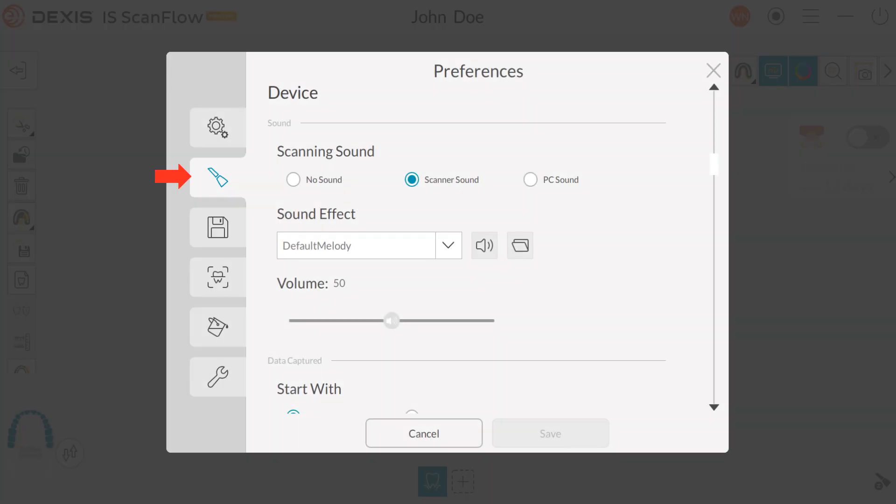Under the Device tab: choose No Sound if you prefer not to hear a sound while scanning. Scanner sound indicates a beeping sound heard each time a scan starts and stops — one beep indicates scanning is in progress, two beeps indicate the scan has stopped and you must re-scan a previously scanned area. A single beep also indicates you have successfully captured a buccal bite. PC Sound — select to have a sound continuously play through your PC when successfully scanning; if the sound stops, scanning has stopped. Click the drop-down to choose your sound effect and drag the slider bar to adjust volume.